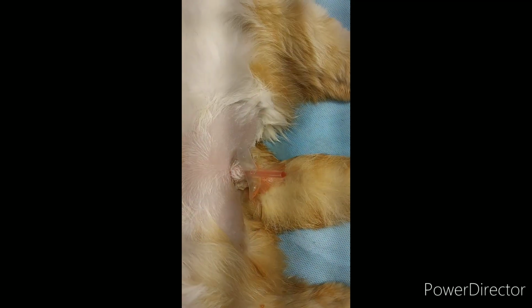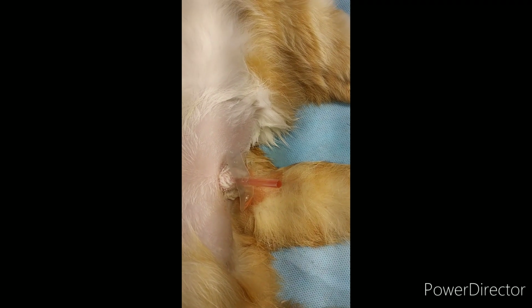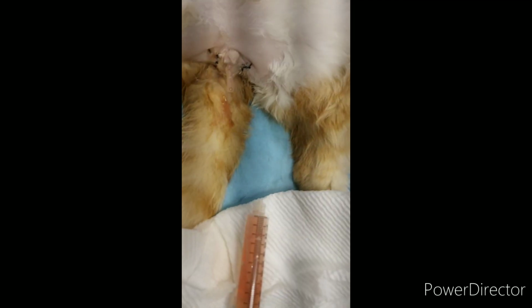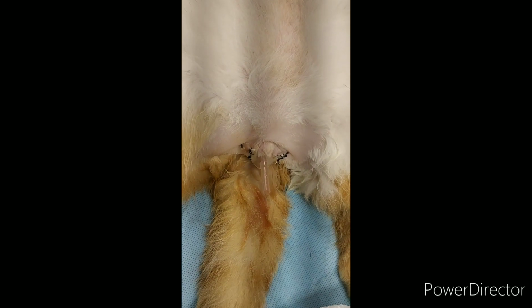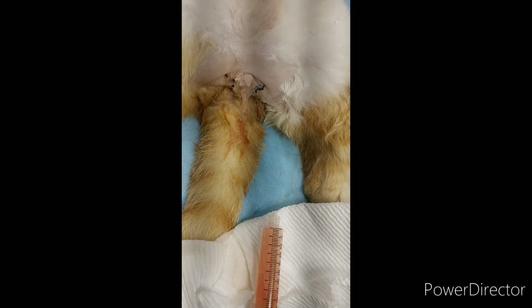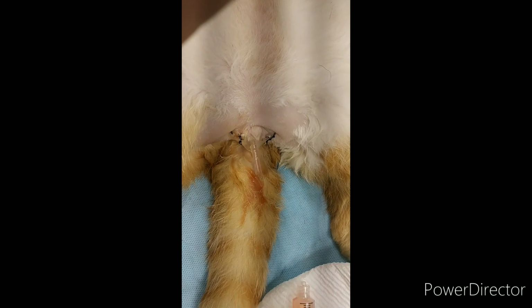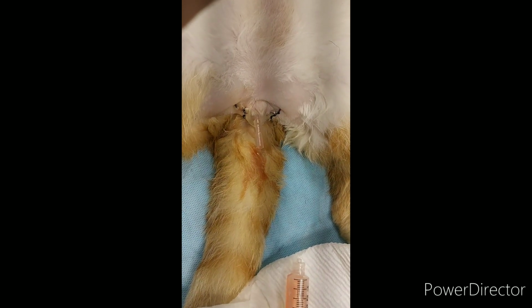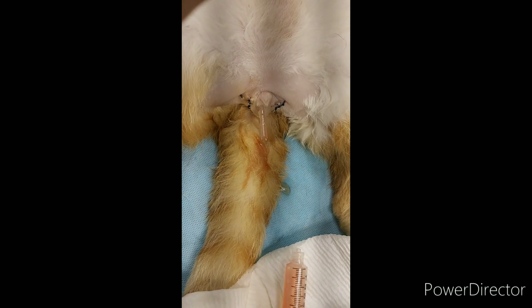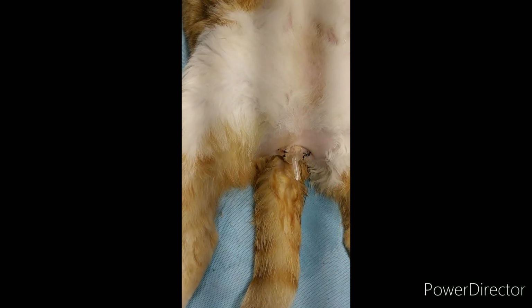All right, let me secure that catheter and start flushing that bladder. All right, the fluid's getting a lot clearer. I figure maybe 3 more flushes, and I'll have it pretty well flushed out. The last thing you need is for this catheter to obstruct with blood clots or crystals or little tiny stones. Okay, it's running clear now. I'm going to give him some fluids.